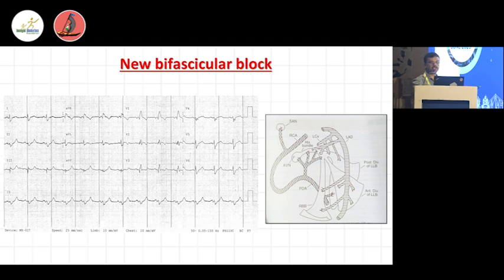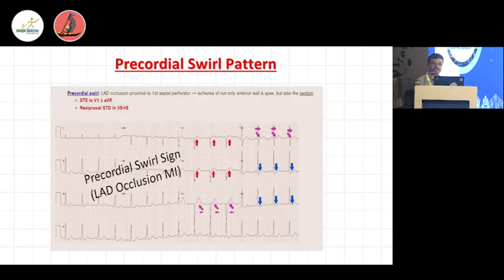Don't confuse it with benign early repolarization, where the patients are mostly asymptomatic and there are no dynamic changes. But pulmonary embolism patients also present with chest pain many times. Here the classical S1Q3T3 is, most of the time, not seen; we get only an ECG picture of sinus tachycardia many times, but otherwise we can also get some RV strain pattern.